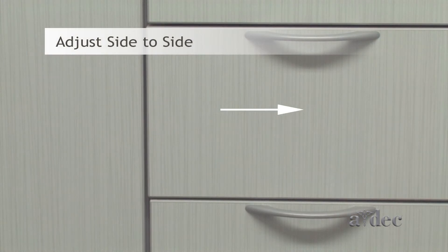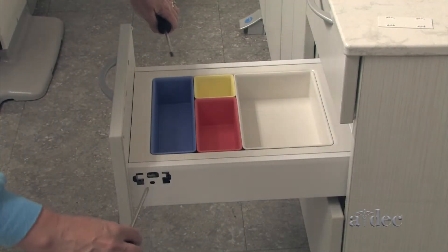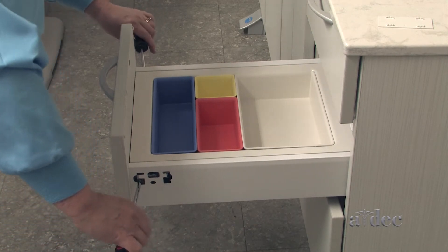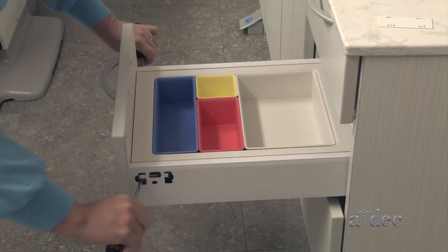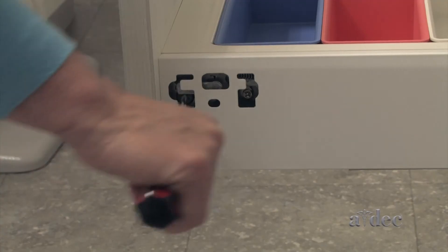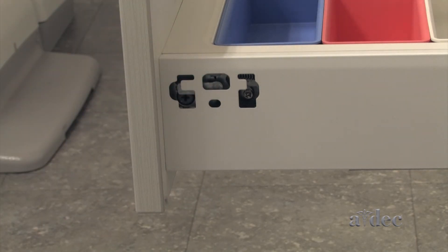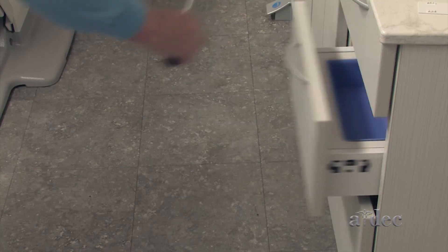To adjust the drawer face side to side, turn the front screw on each side of the drawer at the same time. Rotate both drivers towards the cabinet to move the drawer face right, or away from the cabinet to move the drawer face left.